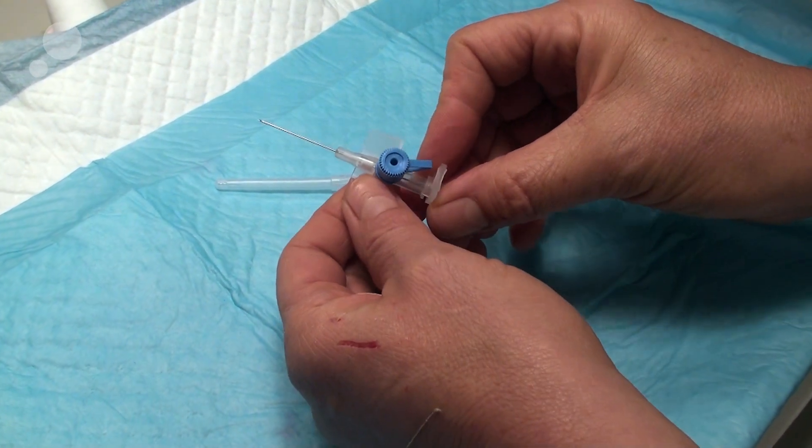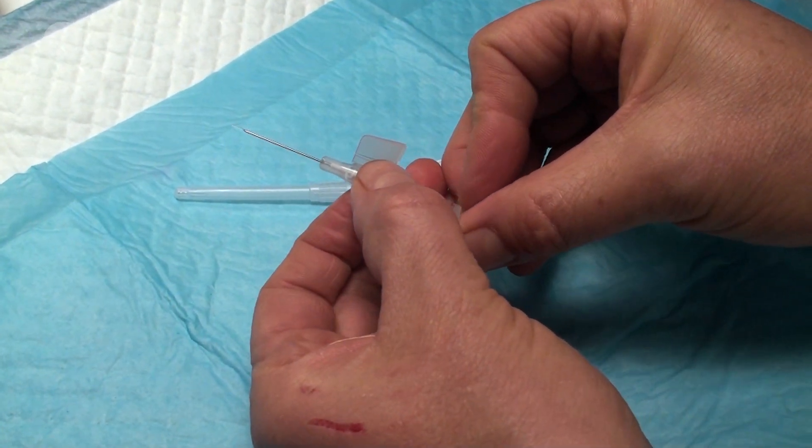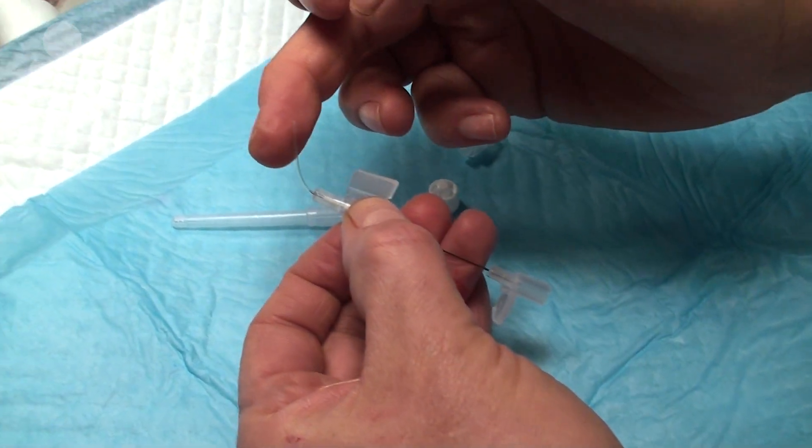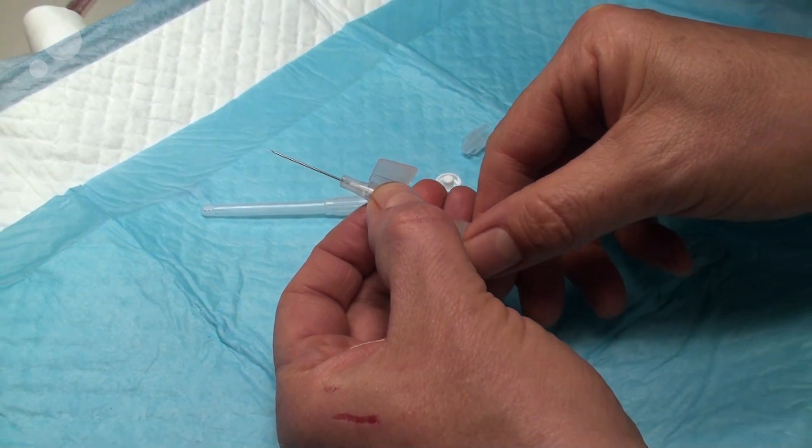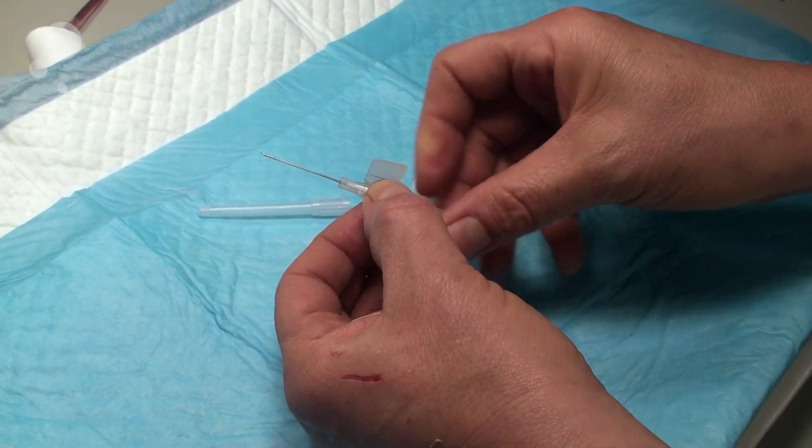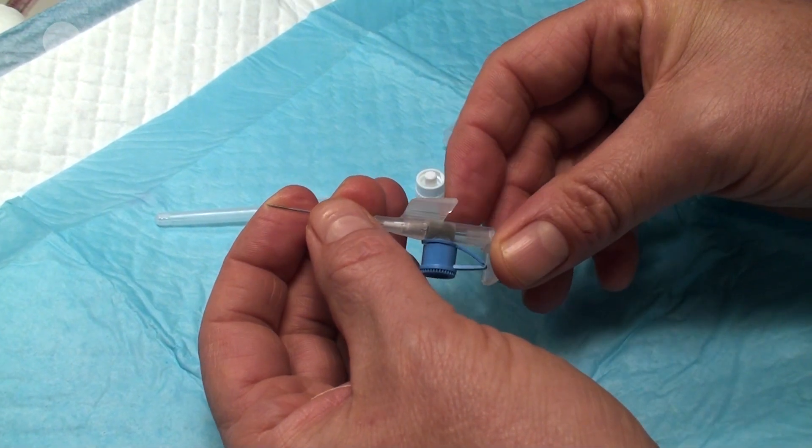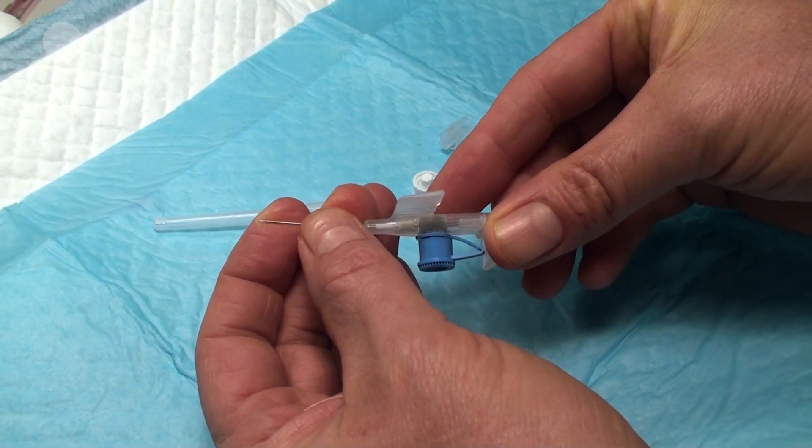When you look at the catheter, you will realize that there is the catheter itself here, and inside the catheter you have the needle. It's difficult to see, but the needle is actually two millimeters longer than the catheter.